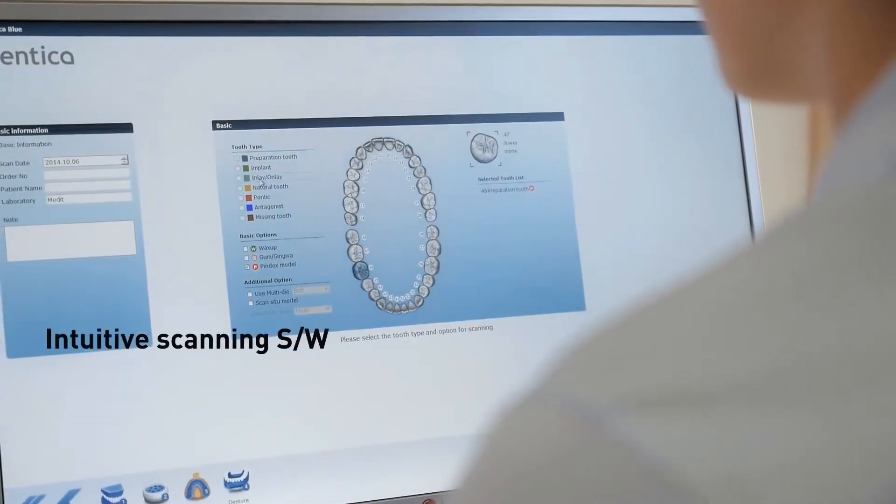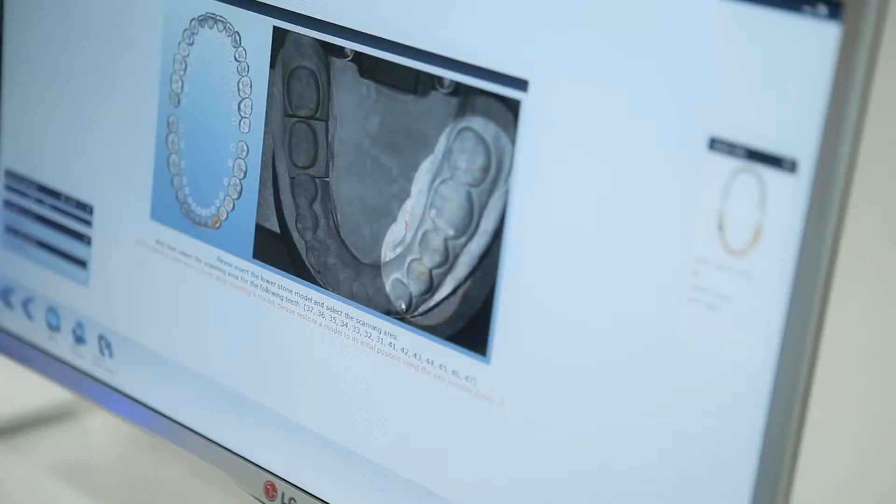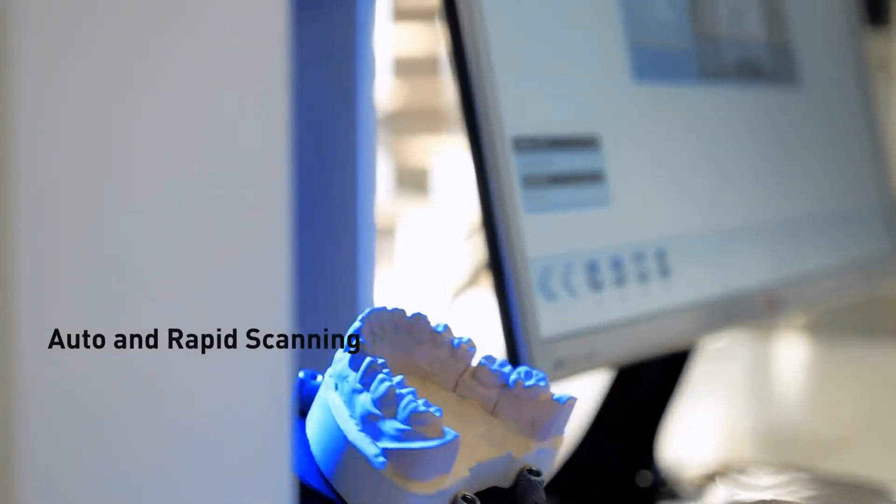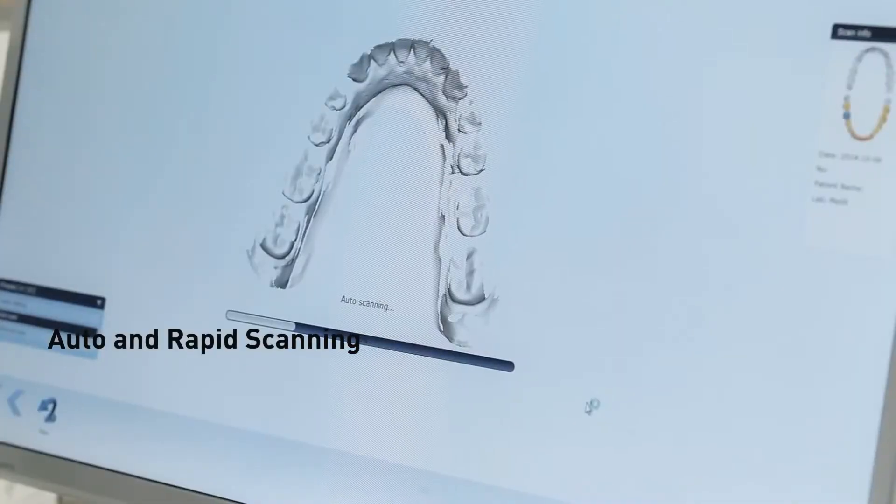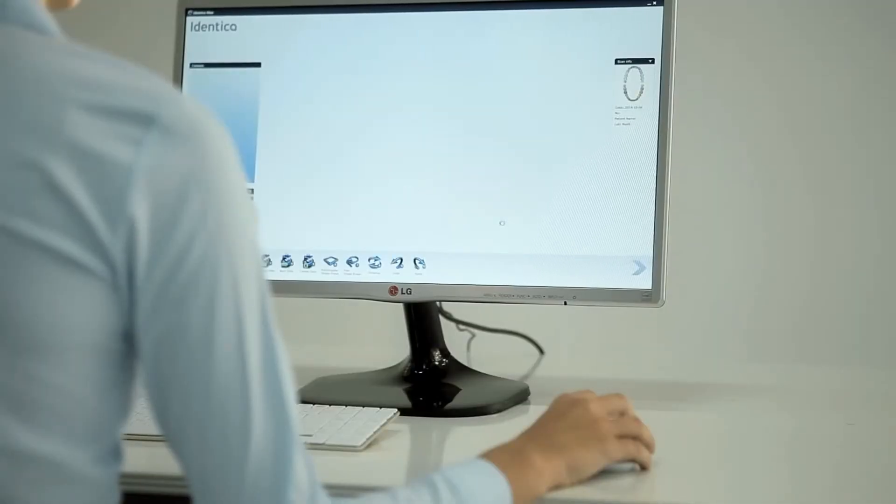Identica Blue's scanning software employs very simple and easy-to-follow scan sequences. Simply select the scanning area, then press Next to start the auto-scanning sequence. Auto-scanning allows the operator extra time to handle other tasks increasing productivity. The easy-to-follow scan software will help to expedite the operator's workflow.